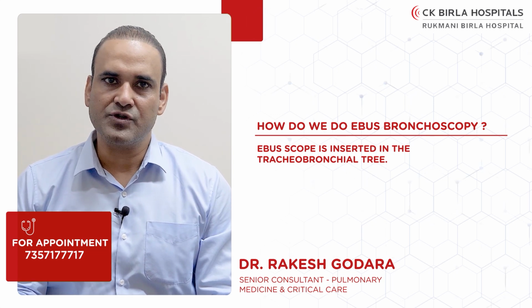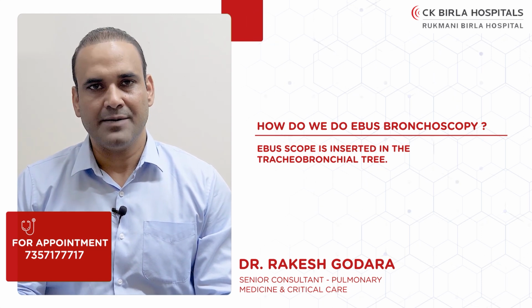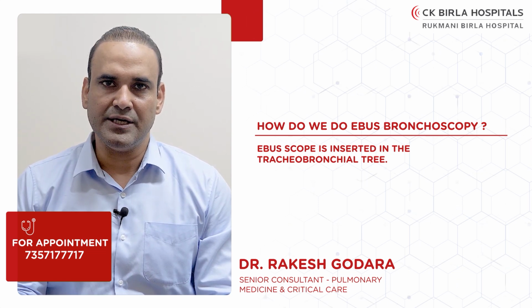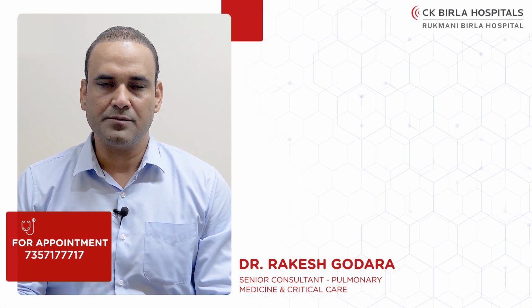Generally, it is a day care procedure and the patient can be discharged on the same day after a few hours of observation. Sometimes post-procedure, the patient might have a slight cough and a fever that subsides with an antipyretic. What is the diagnostic yield of EBUS bronchoscopy?